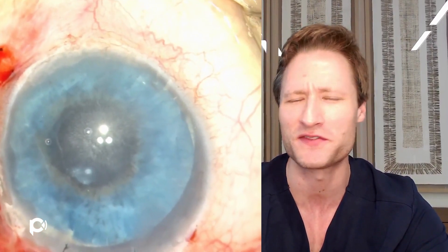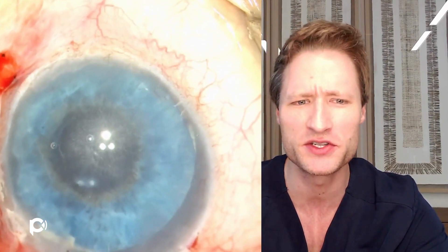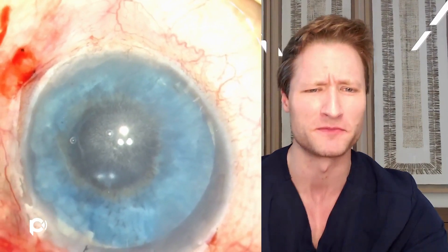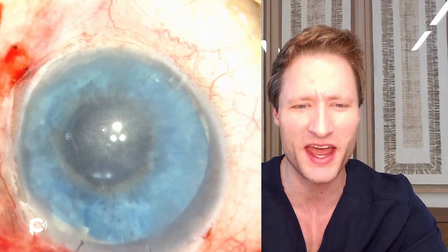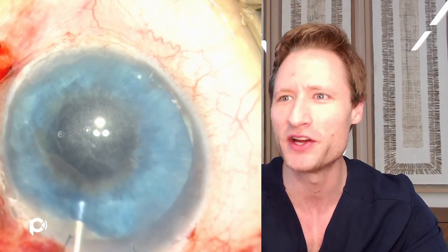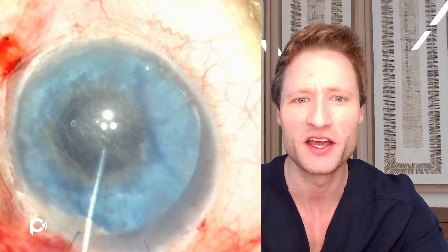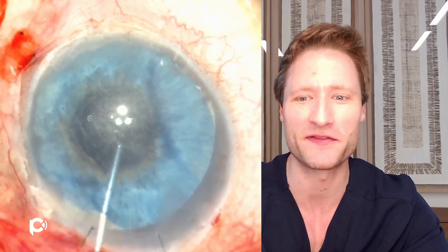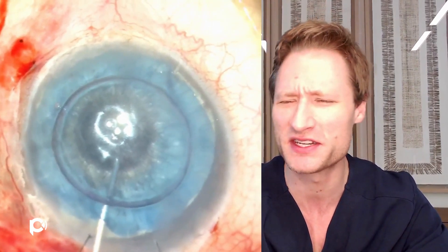We've managed to unfold the graft on top of the artificial iris and now we're ready to lift it up to the posterior corneal surface atop an air bubble. Even though this is a complex indication — ICE syndrome with aniridia and an artificial iris — the operation proceeds completely straightforwardly using a large-diameter graft. There are a few learning points to take away from this case.